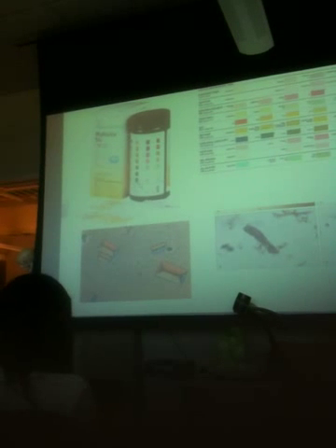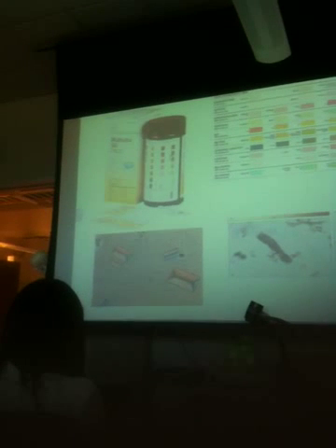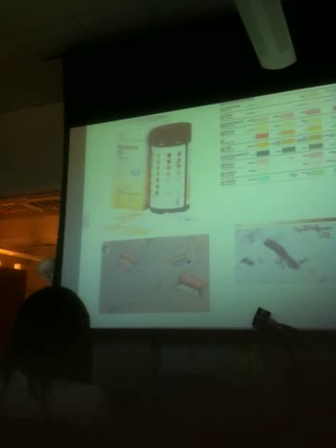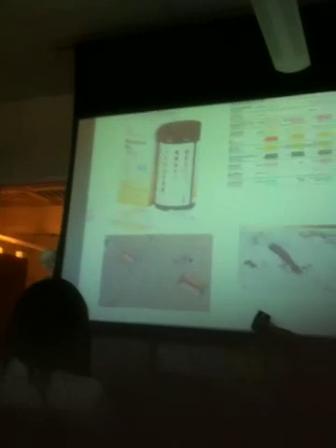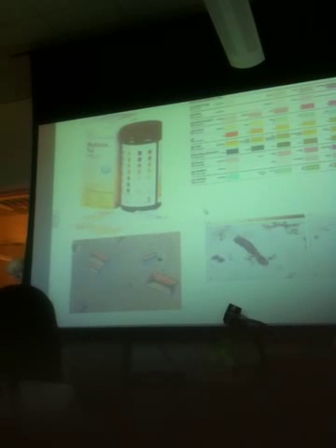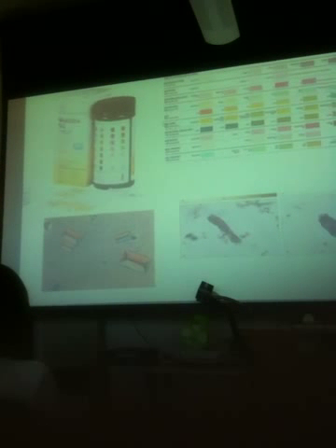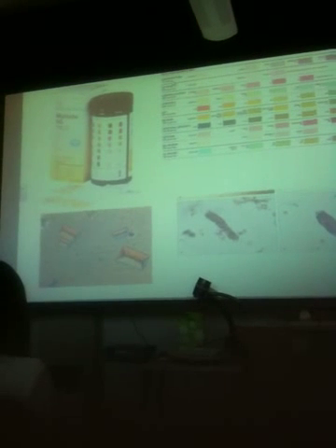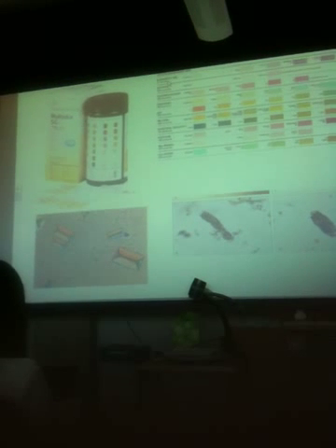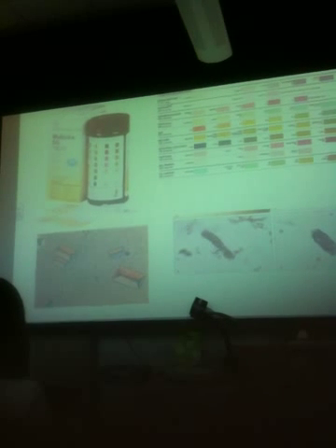Leukocytes, nitrates, specific gravity, blood, bilirubin was another one on it. Ketones is another one. And again, you can see it right over here. There's the list, right? So some of these are chemicals, obviously nitrite and urobilinogen and protein. What are you testing leukocytes for? Because normally you wouldn't have significant leukocytes in urine. What do they indicate? Infection, right.